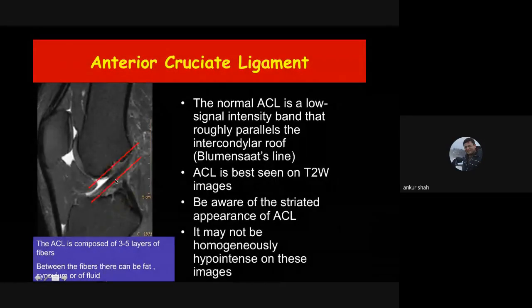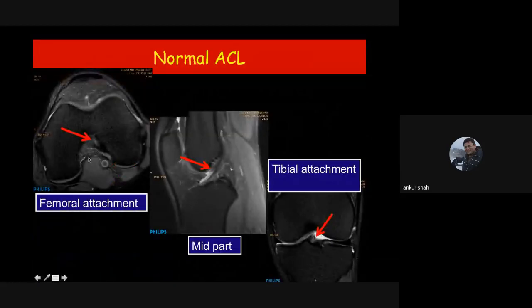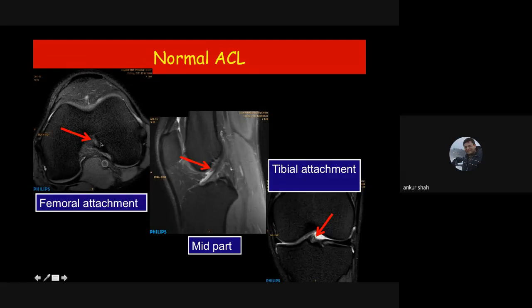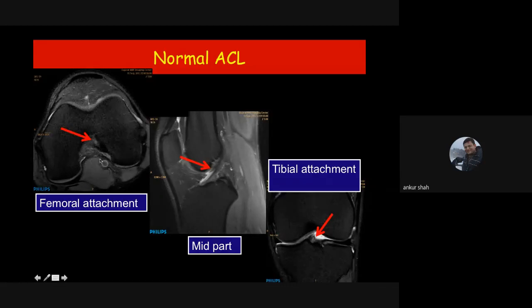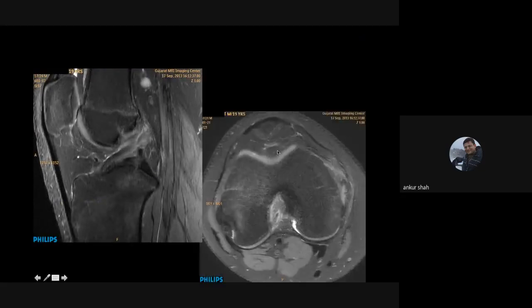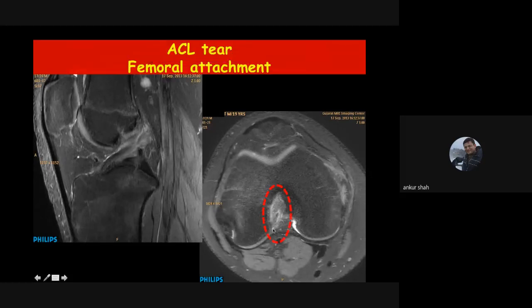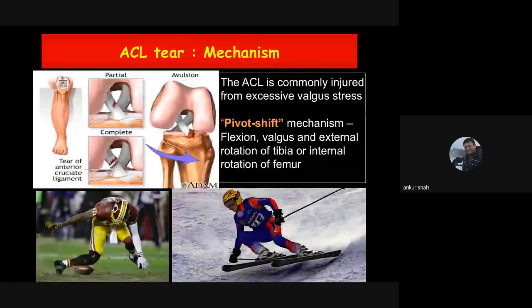Many knee joints are reported as ACL partial tear or ACL edema when actually it is just the normal heterogeneous appearance of the ligament — between the multiple layers of fibers there is fat, synovium, and fluid, giving a heterogeneous appearance that is absolutely normal. For ACL, you have to see it in all three imaging planes because it is an oblique structure. In the sagittal plane you see the mid part best; for femoral attachment the most important sequence is axial; for tibial attachment the most important sequence is coronal.